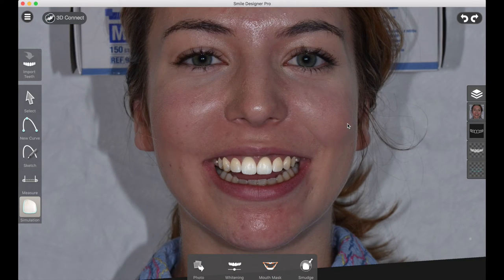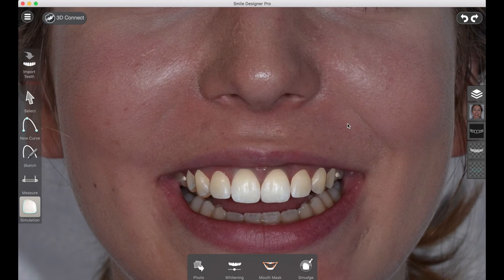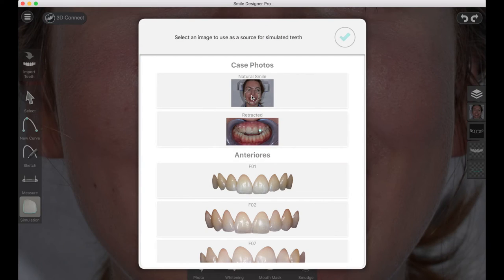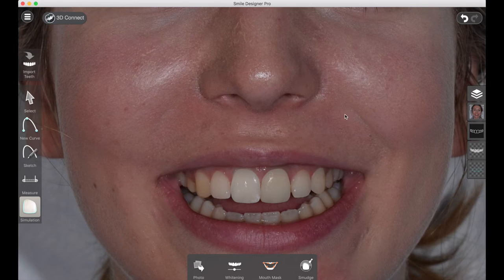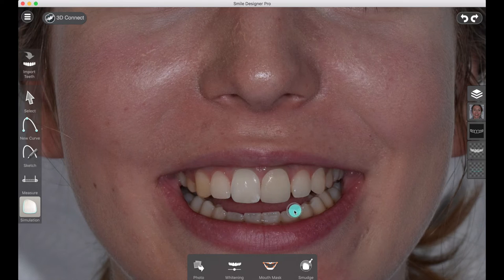That looks pretty good, but we can do better because this particular patient has some teeth we can work with. We're going to click on the photo button in the simulation tool and select the natural smile photo as a source for simulation.